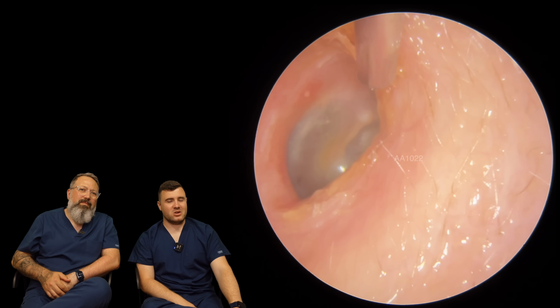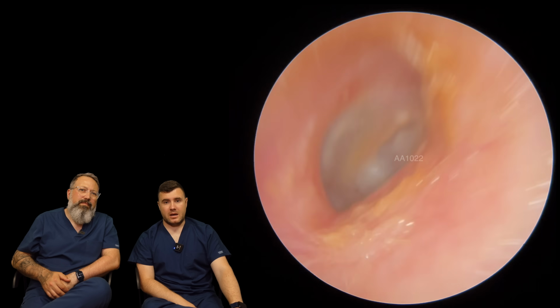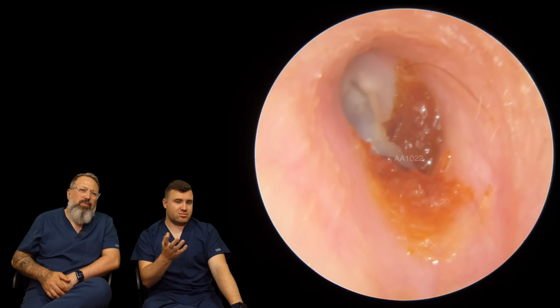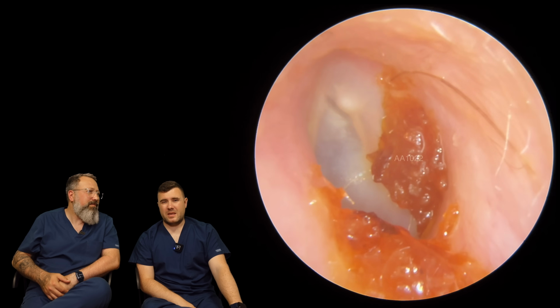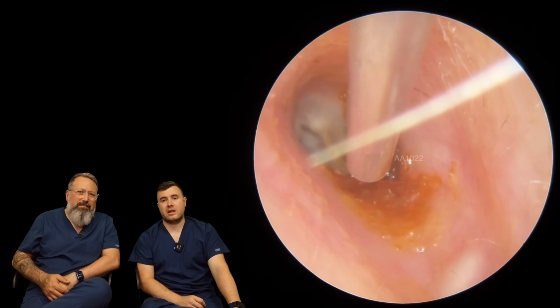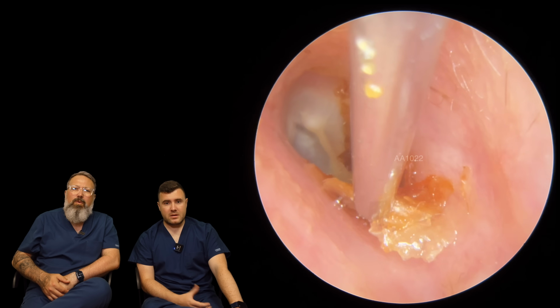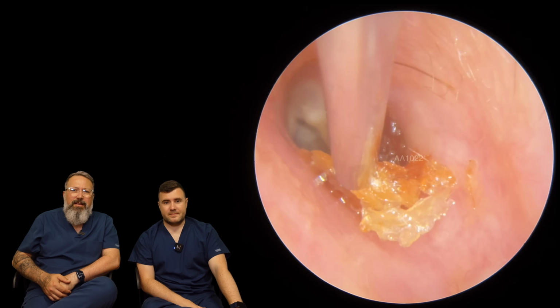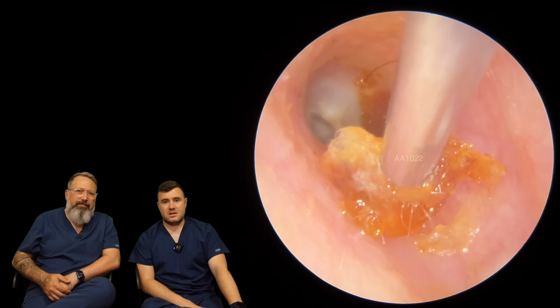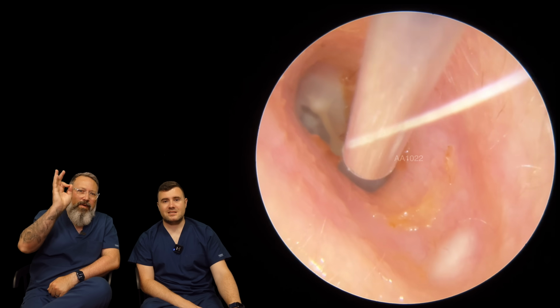I'm not overly concerned about this little bit at the top here. Again, just because of the tinnitus, I didn't want this to whistle. It looks nice and soft. The patient has been using a bit of oil in both ears, to be fair, which does really help. That's what you want to see. That's a lovely peel. That's the perfect outcome, yeah. We just drop on it and up it comes. There it goes.